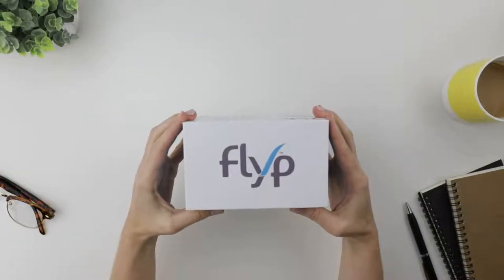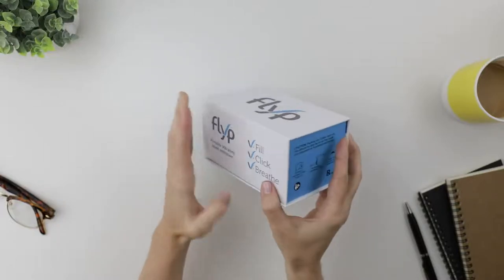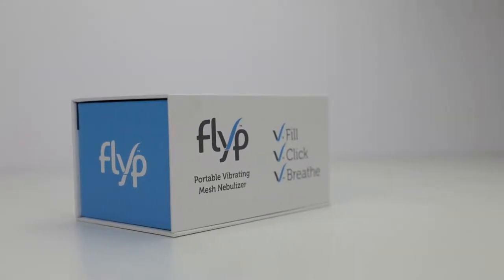Hey guys, I just got this new nebulizer called Flyp, and I'm really excited to see what it's all about. Fill, click, breathe — that sounds easy. Tiny box. I still can't believe there's a nebulizer in here, but how cool is that?